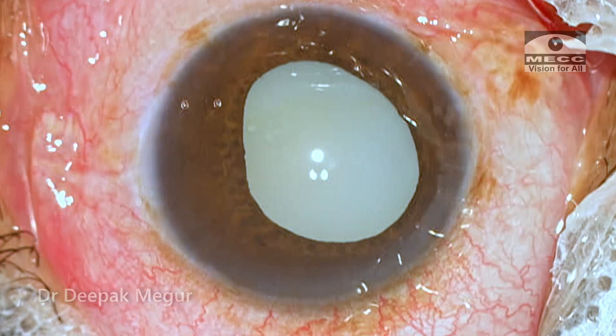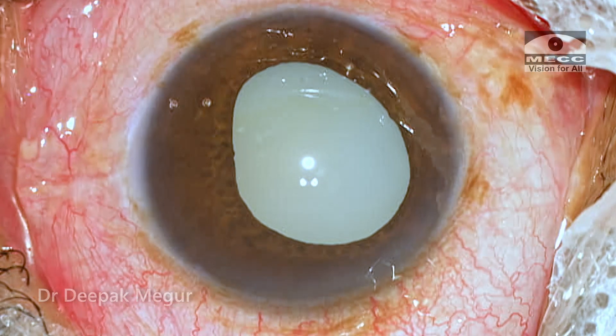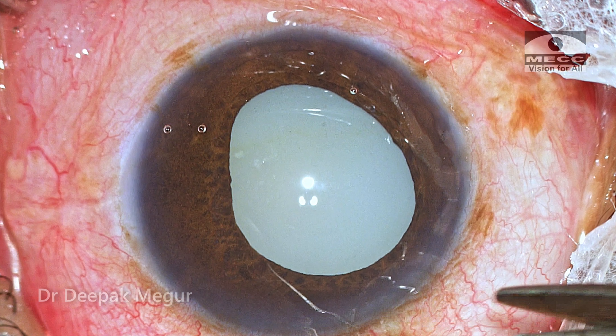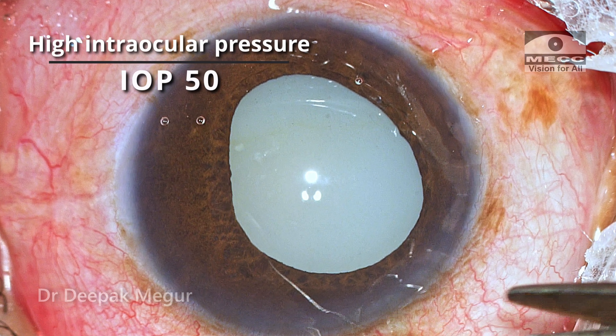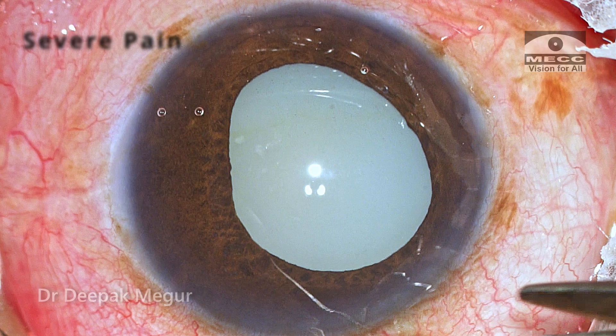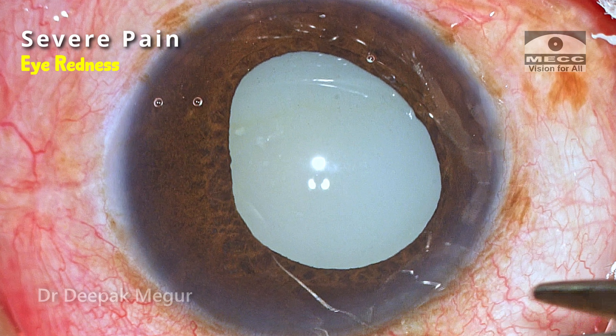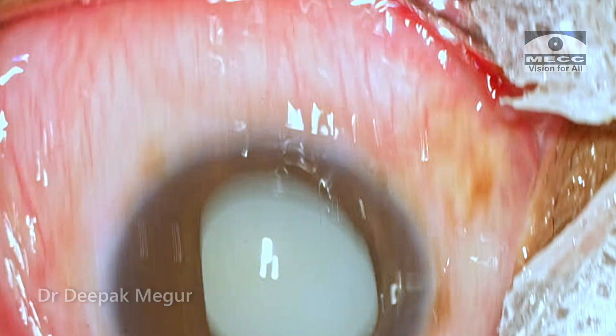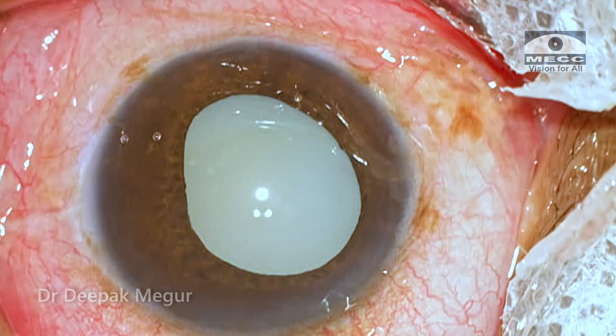This is a case of lens-induced glaucoma in an elderly lady. She is around 80 years old and presented with intraocular pressure of more than 50 millimeters. She had severe pain and was admitted to a general hospital thinking it was some other condition, because she was having intractable vomiting because of the glaucoma.